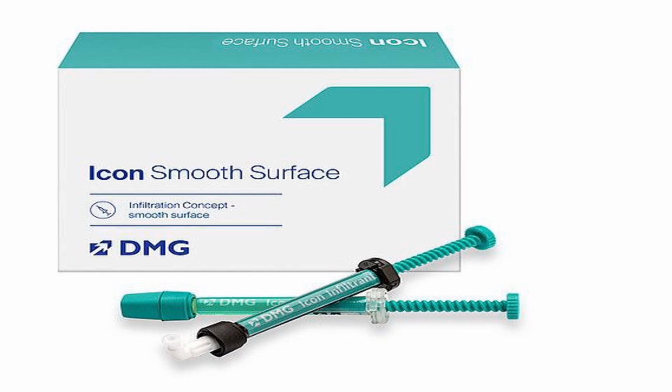So, resin infiltration technique is a novel technology that bridges the gap between prevention and restoration of a carious lesion up to the first third of dentine and can camouflage aesthetically disfiguring white spot lesions on the buccal surface. It is marketed under the name ICON and is described as a micro-invasive technology that fills, reinforces, and stabilizes demineralized enamel without sacrificing the healthy tooth structure. Resin infiltration was developed as a technique to treat enamel caries.